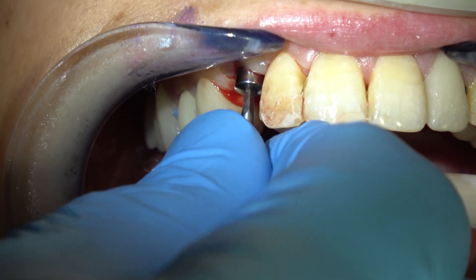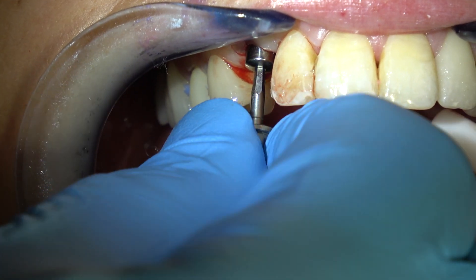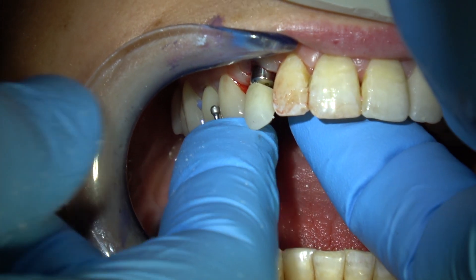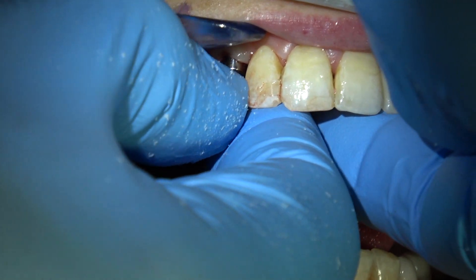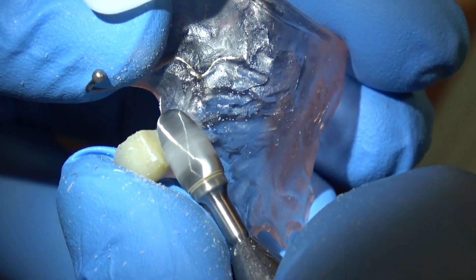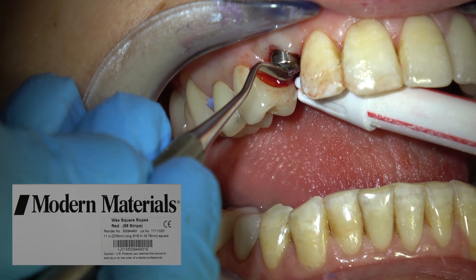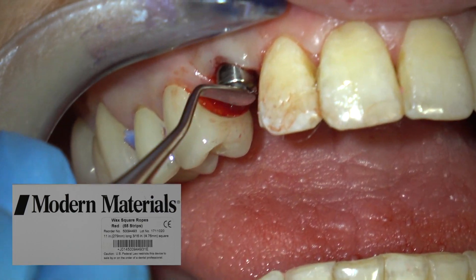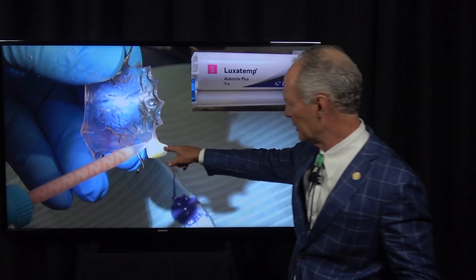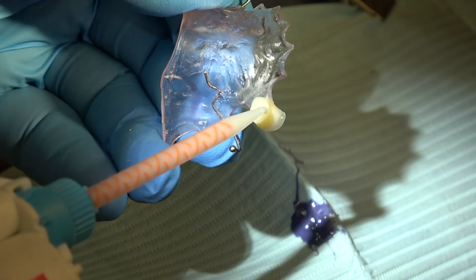I'm going to hand-tighten this — I'm not going to screw it down to 35 Newton centimeters. You can see the blanching, so this is good. Now we're going to place a removable flipper as a provisional. You want to be sure that the artificial tooth doesn't contact the healing abutment. So I'm putting a little rope wax in the hole of the healing abutment and squirting Luxitemp around it to basically take an impression of that healing abutment.